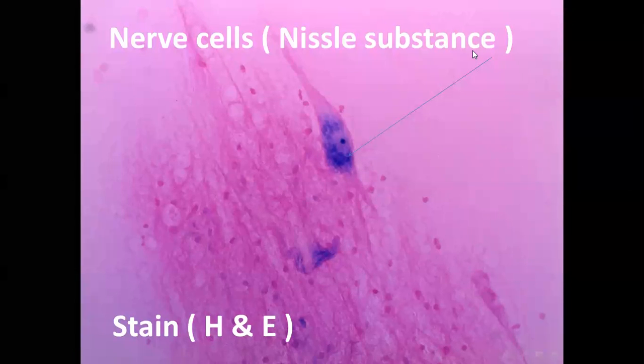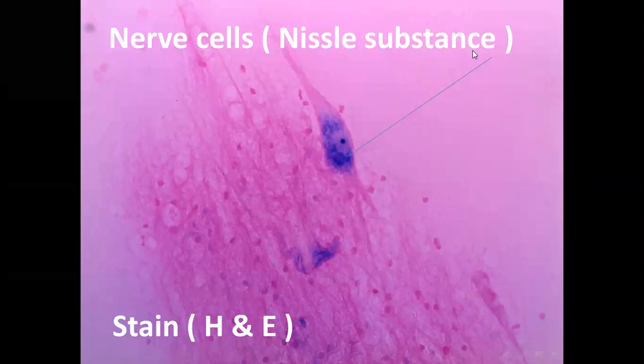Practical histology. This laboratory is about the cytology practical. We take the cytology theory. Cytology is the study of the structures of the cells which make up tissues and organs. In this laboratory, we deal with the shape of the cells, which are the smallest unit of the living matter of the multicellular living organism. Each cell in the body differs in shape, structure, and size.